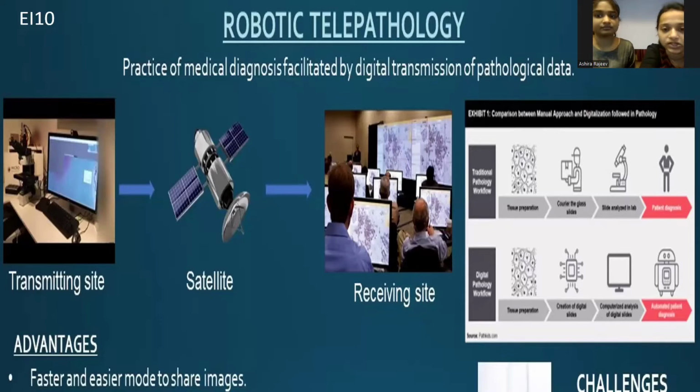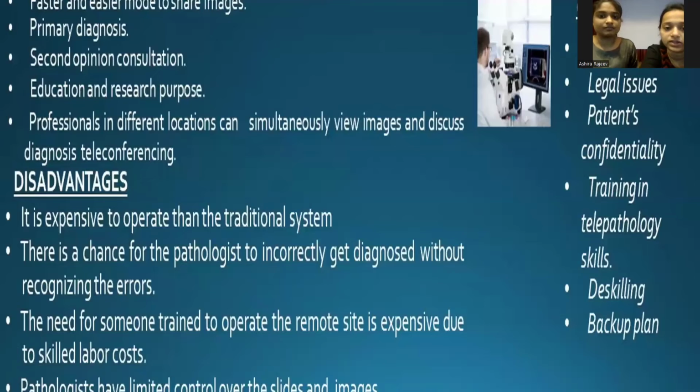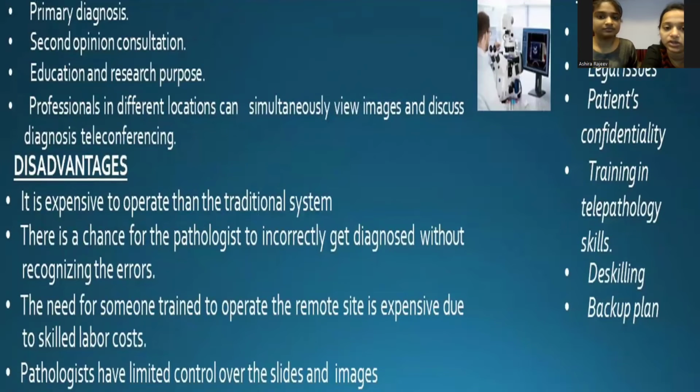Robotic telepathology can be used for remotely rendering primary diagnosis, second opinion consultation, quality assurance, education and research purpose. Medical professionals in different locations can view images simultaneously and discuss diagnosis through teleconferencing. Patients' data can be synchronized across various electronic health information systems.